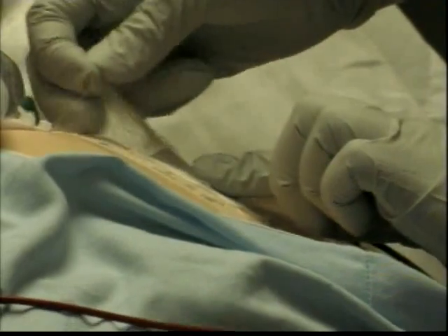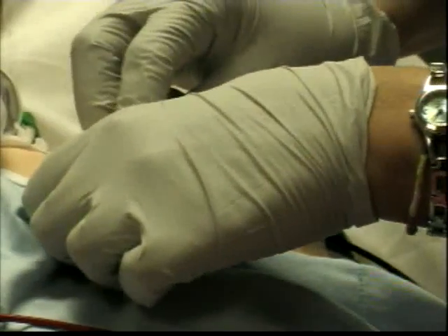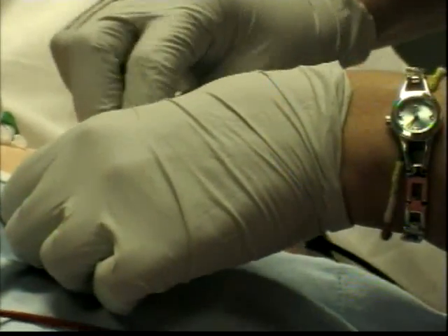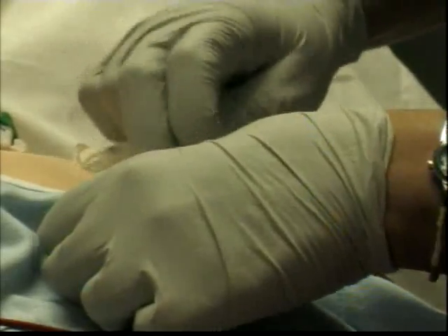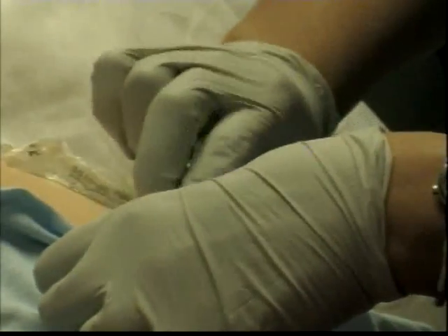You have to be very careful about not pulling the skin of the patient, and you want to probably just hold the skin taut, and then pull the dressing away from the skin, and you want to gather in the middle of it. You want to pull in, holding the skin taut.